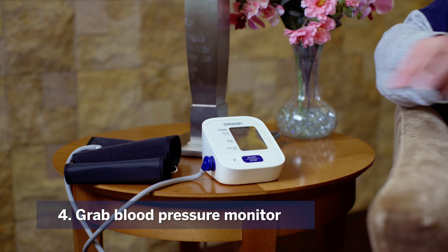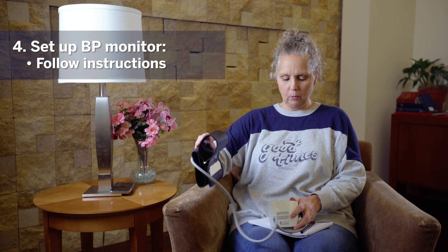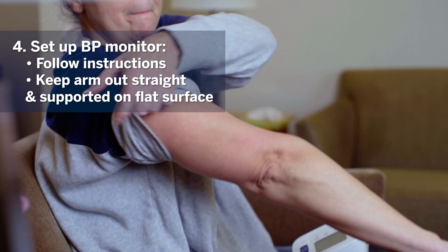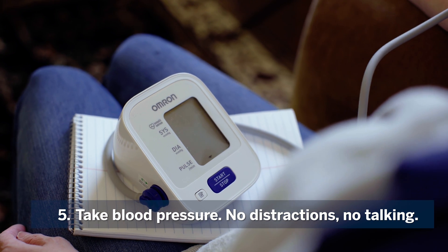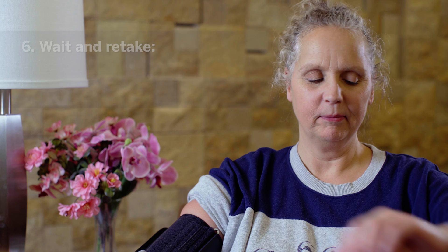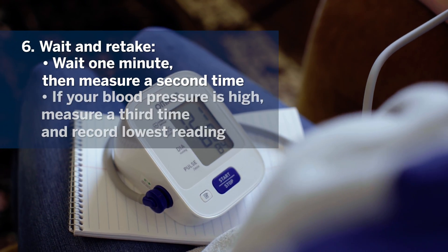Take your log sheet and pen out so that you are ready to record your measurements. Grab your blood pressure monitor, set up the cuff per its instructions, and make sure your arm is out straight and supported on a flat surface. Begin taking your blood pressure and make sure there are no distractions or talking during this time.